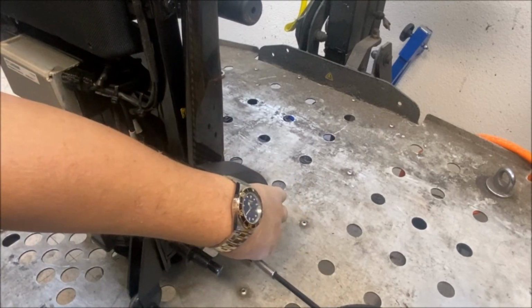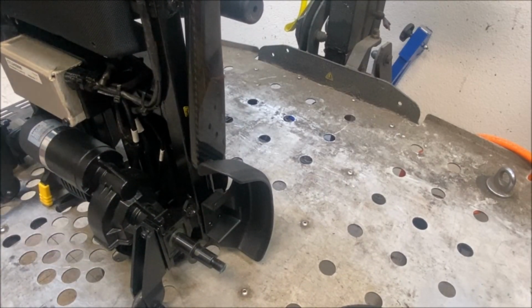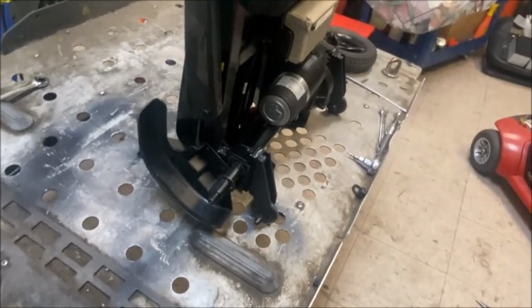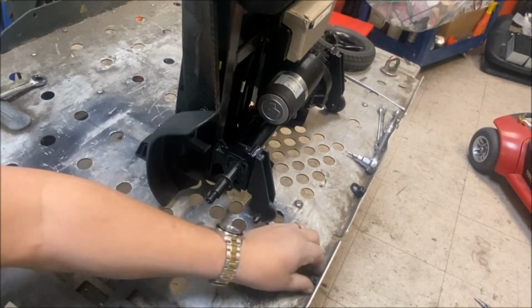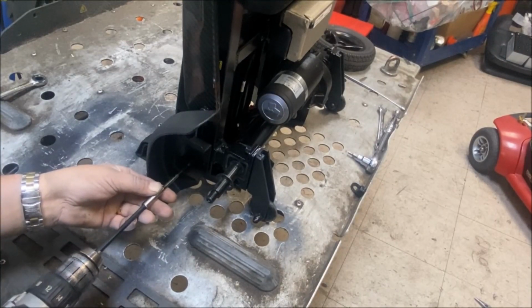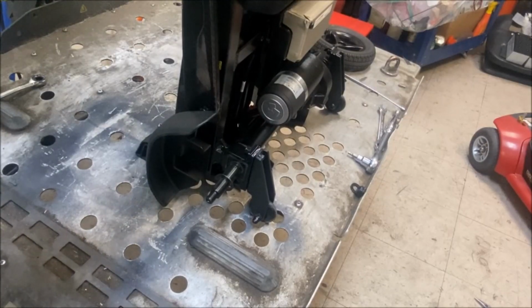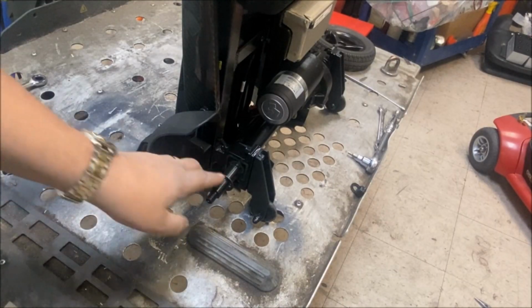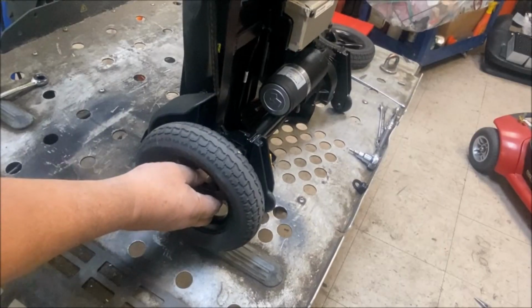Screw on this side. And there's a two on this side. Okay, and I can now tighten these up. Once I unfold it, I'll put the wheels back on. I'm going to put that grease on there, just a bit of grease to help it slide on.